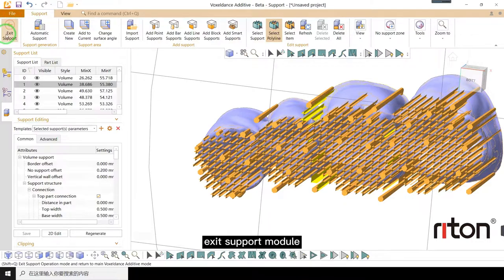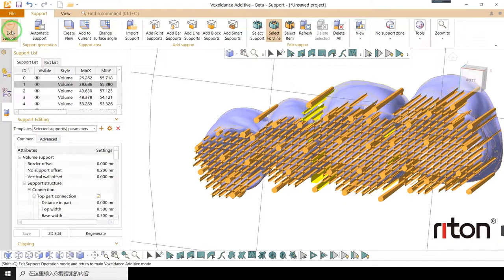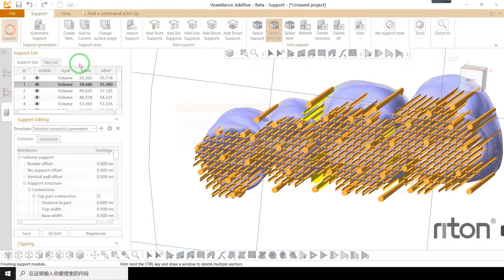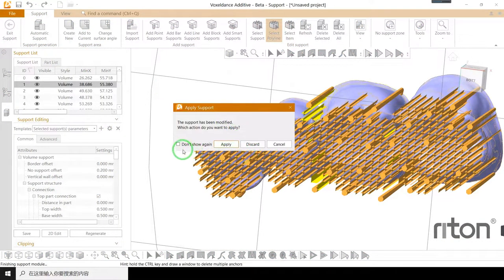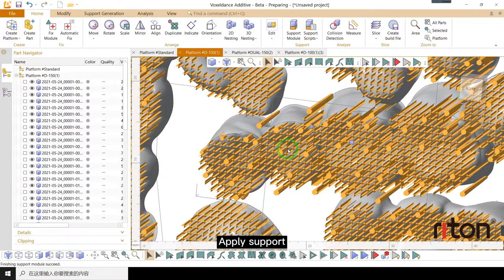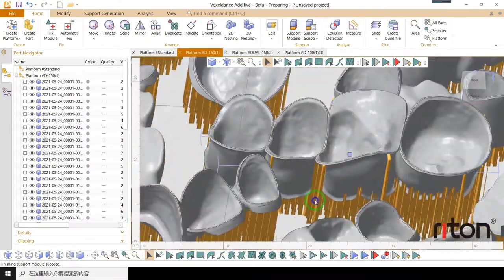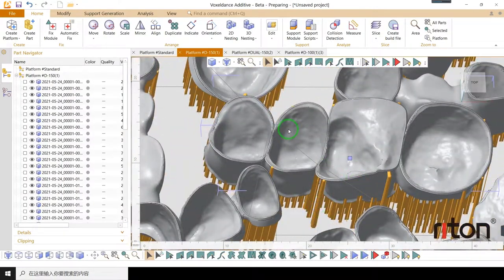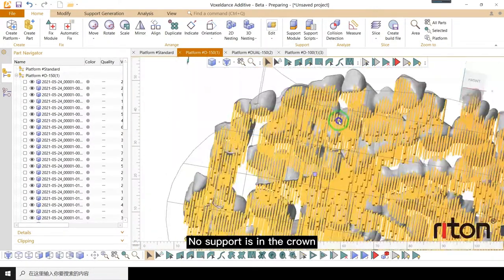Exit support module. Apply support. No support is in the crown.